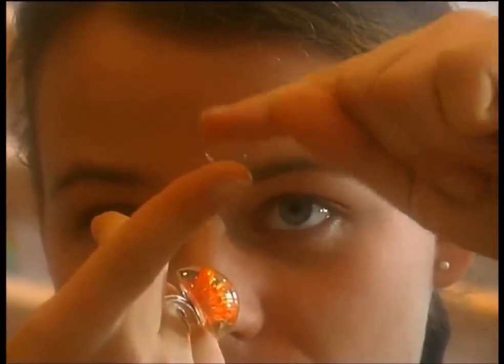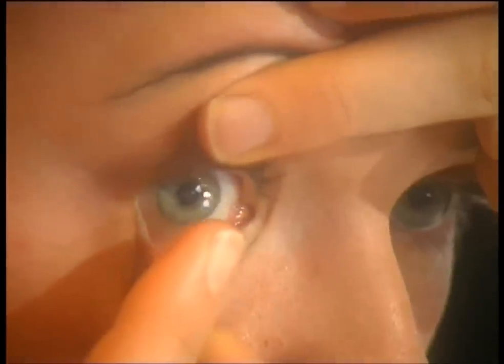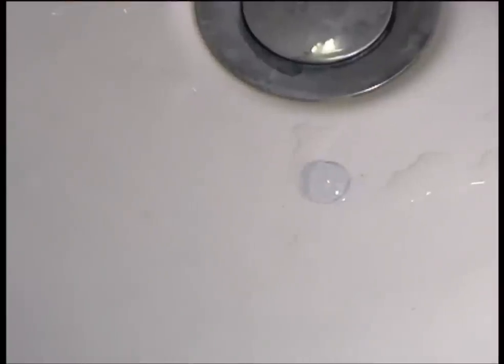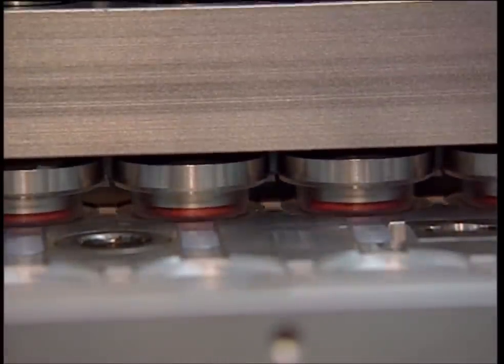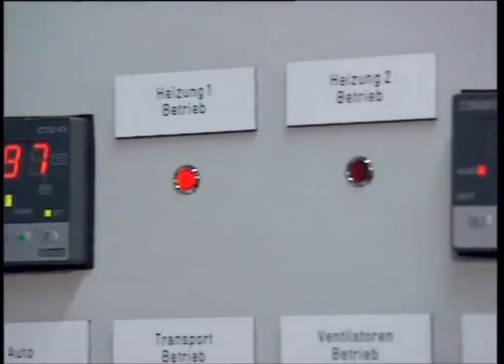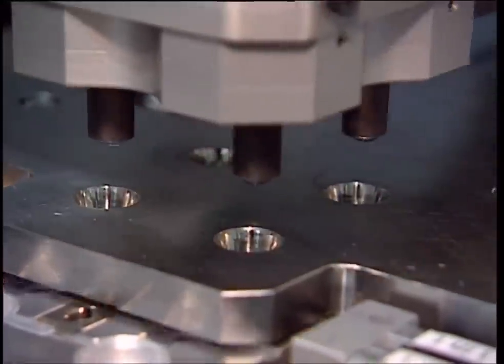An alternative to hard lenses are soft ones that adapt themselves to the eye. They're cheaper and more convenient for some users as they're disposable. They start out as a plastic liquid — a blue dye is added, which helps users find the lenses when they drop them. The mix is poured into plastic molds, a cover is put on top, and it's baked at 97 degrees Celsius for 10 minutes. Each lens then needs to be checked for scratches and cracks.